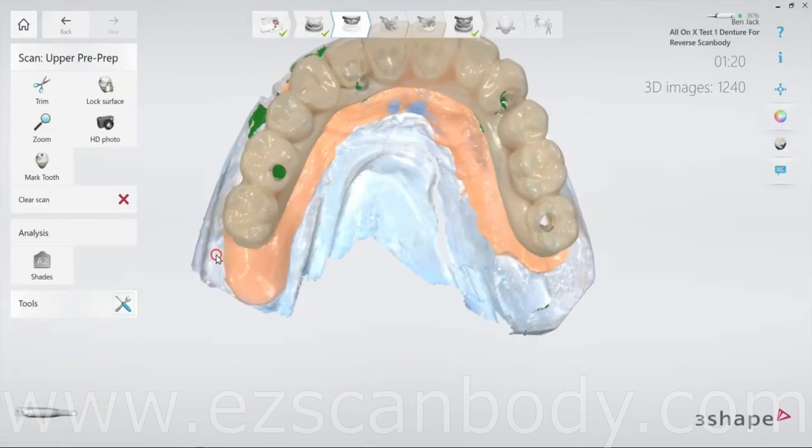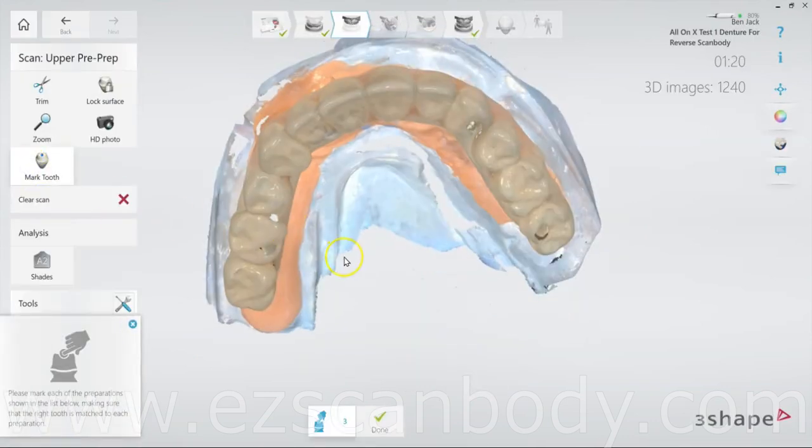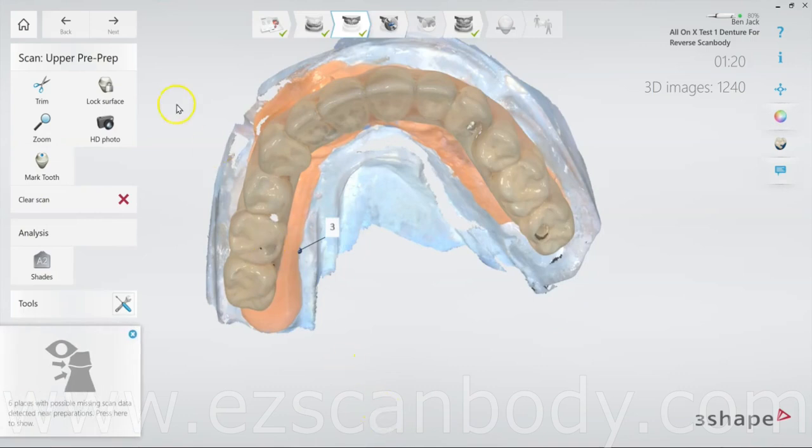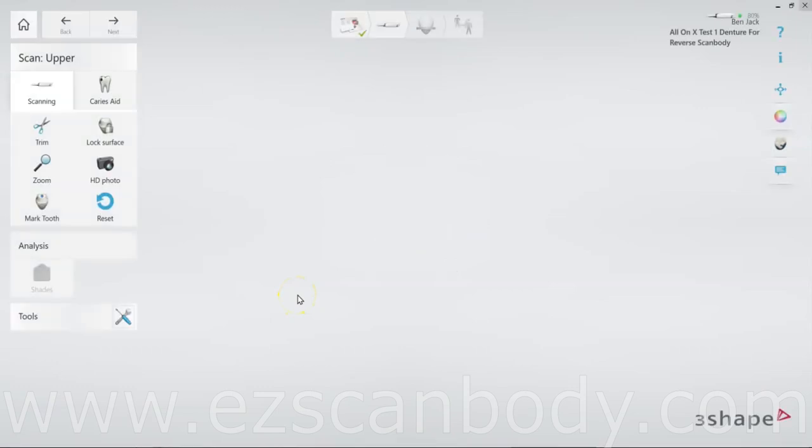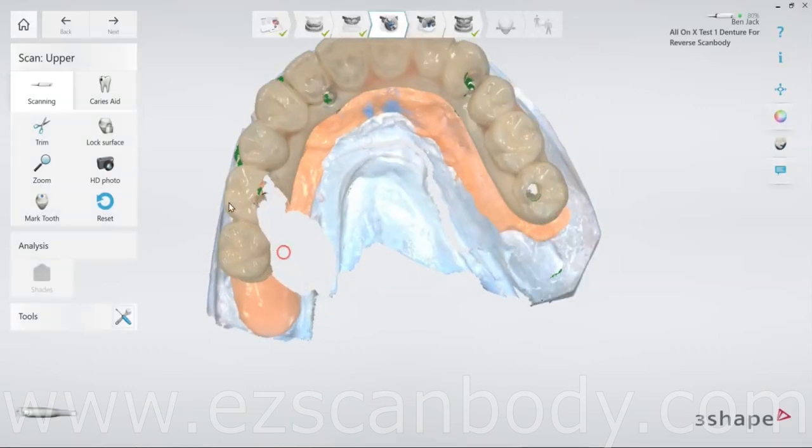Before proceeding to the jaw scan, click Mark Tooth in the 3Shape software and select any tooth. This step is necessary because the scanner anticipates crown preparation and won't proceed further. This is why we don't mark and cut the tooth before taking the bite registration — if we do, the software may remove too much of the tooth structure, leaving insufficient data to capture an accurate bite.